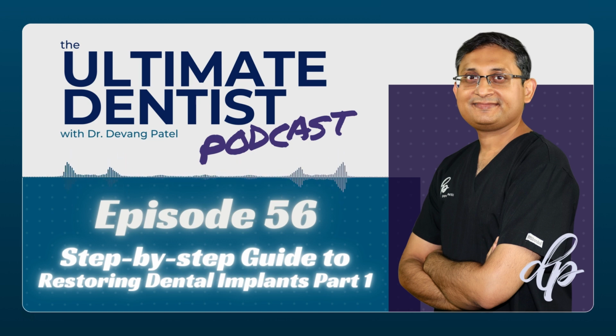I used to have a technician in Italy, and he used to give me all the indications, because many times, if you're doing a central incisor restoration, you may find a better result if you do a little bit of composite bonding on either side of the teeth to close the space, to get the space distribution really well. And this is something you may not be able to assess straight away unless you have models in hand and you're doing the work.